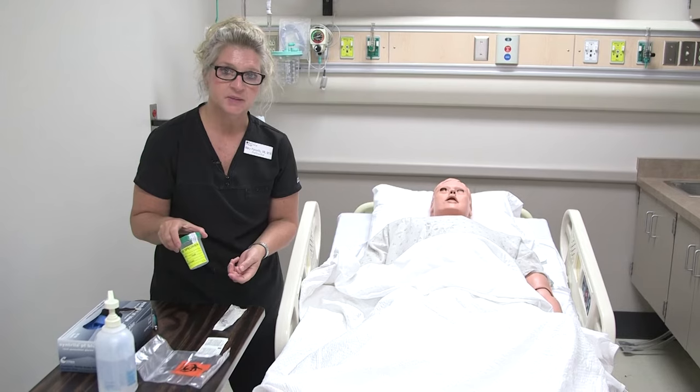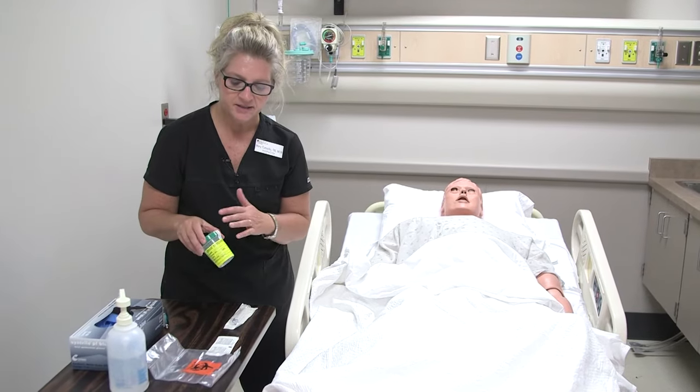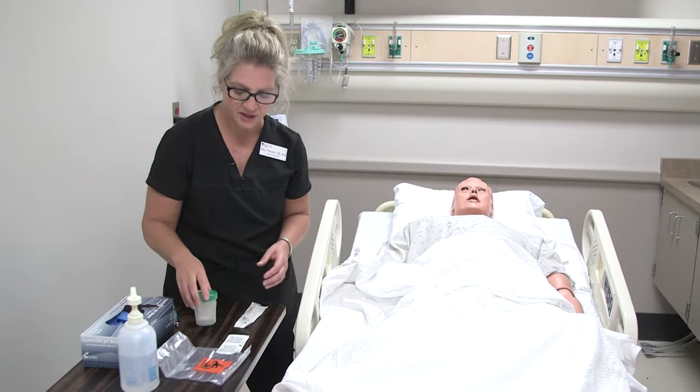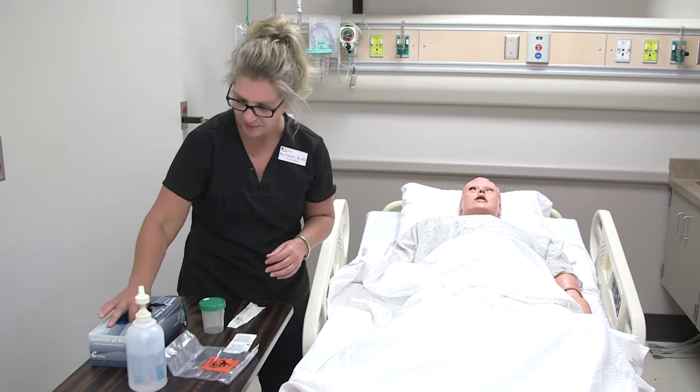I already have a sterile specimen collection cup. It's sterile because the seal isn't broken. I've already labeled it with the patient's information, and I'm going to go ahead and begin.